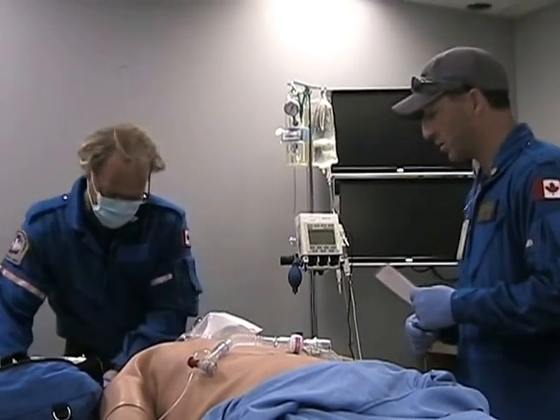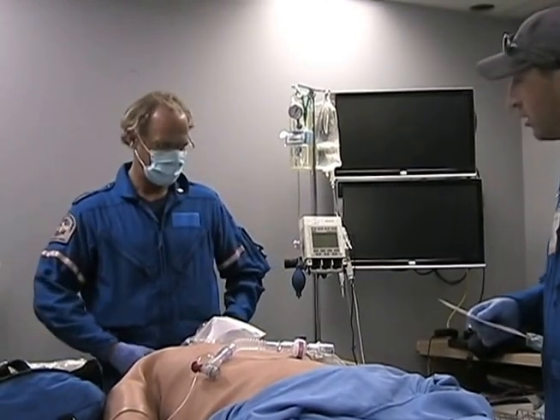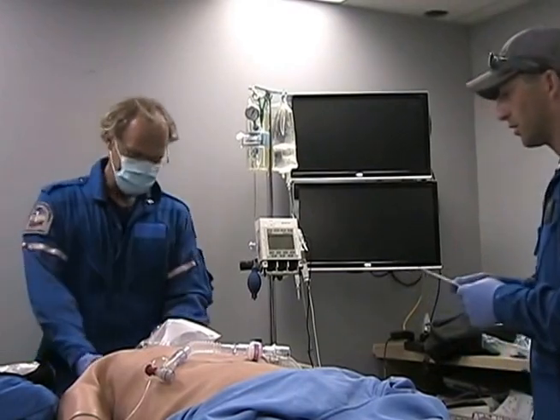All right, if you've got that stuff checked, I think we're ready to go. Why don't we go through the airway checklist and then we'll get this guy intubated. Okay, great. Okay, so patient positioned properly. Patient is positioned properly.